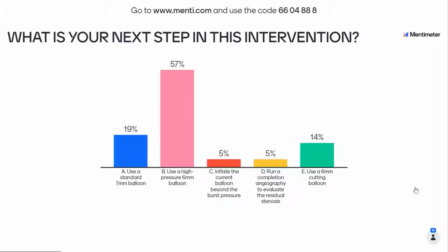Results, please. Thank you so much. So let's see what the audience was thinking. The majority was voting for a high pressure balloon. And I think they go with you, Matteo, and I think I would do the same thing. To increase the size or to use a cutting balloon were also chosen.